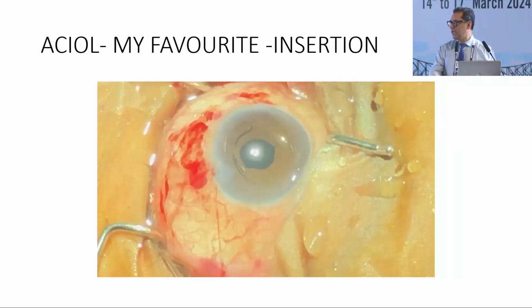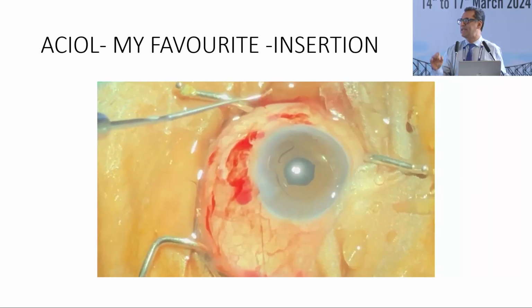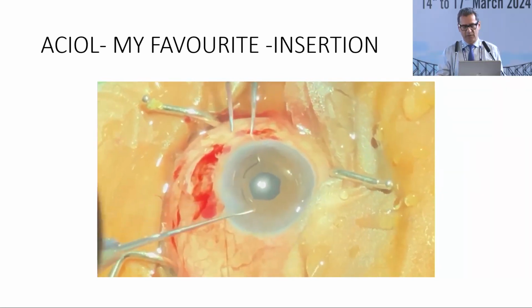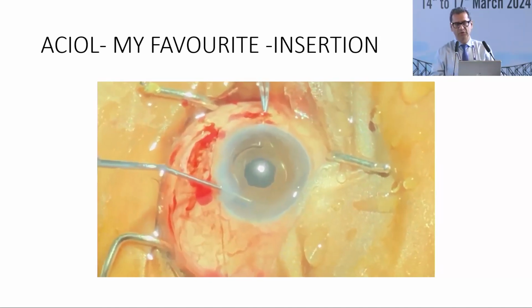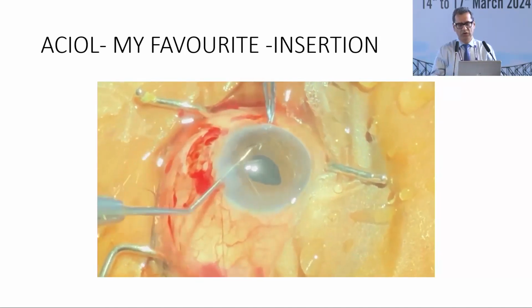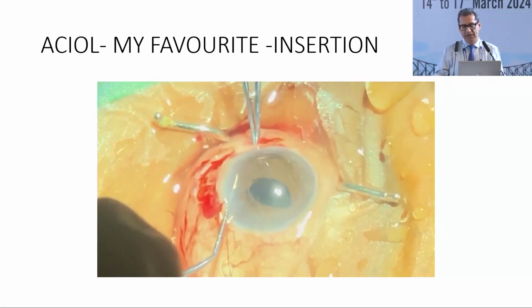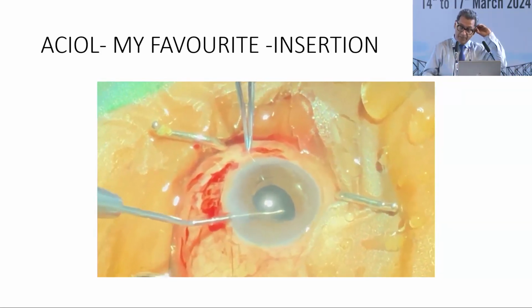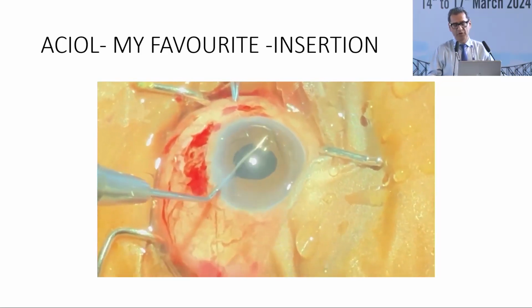I'm sure Dr. Keki Mehta has used a lot of these lenses, and Rayner used to make the best AC IOL, which they've unfortunately stopped making now. In these patients, always make the haptic horizontal, because you don't want the upper lid to cause a UGH syndrome in these patients. And please don't forget to create a vitrector peripheral buttonhole iridectomy, because this is going to cause a pupillary glaucoma if you don't do a good iridectomy.